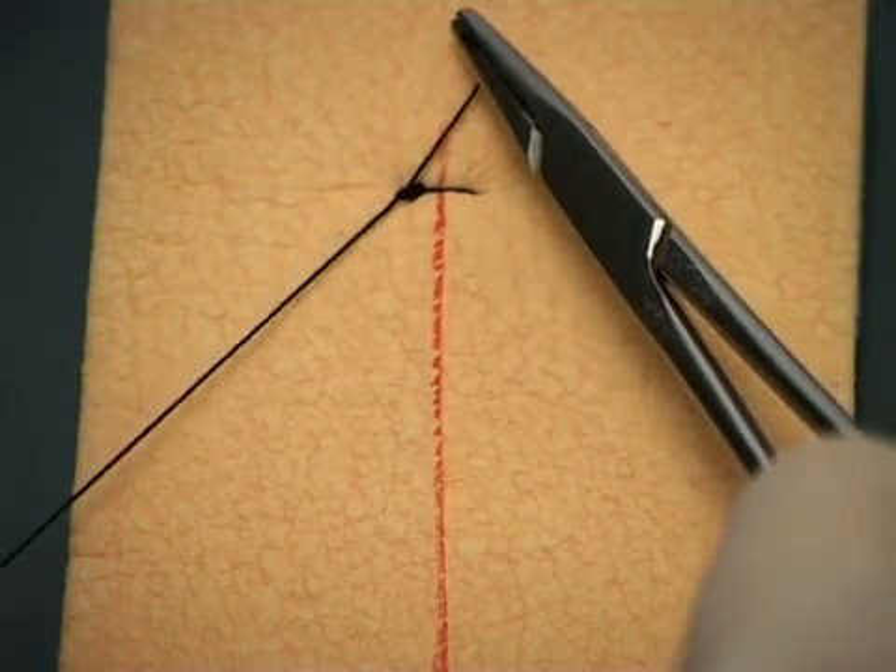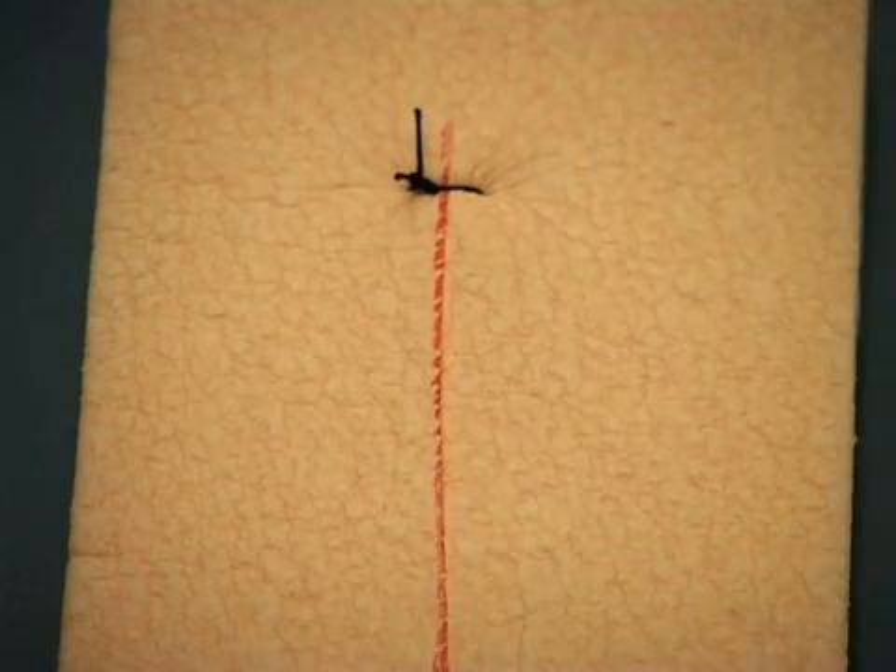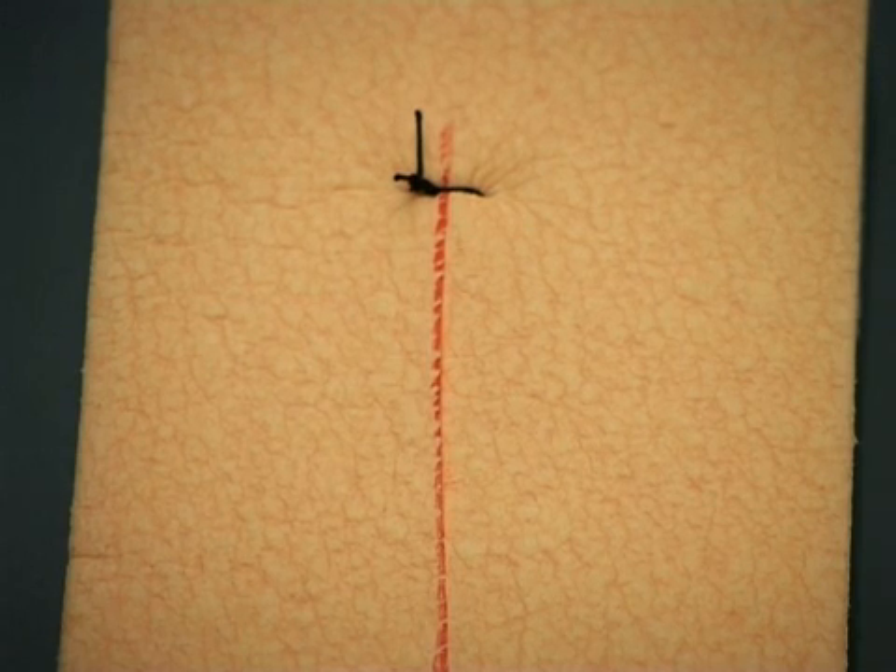Hold the sutures together in this fashion, and your assistant will cut it for you. Cut the suture to an appropriate length. Too short, and there is a danger of the knot slipping. Too long, and it comes in the way of the next suture.